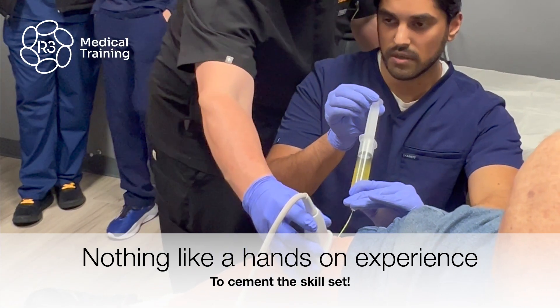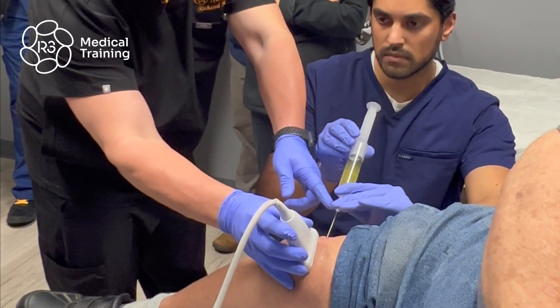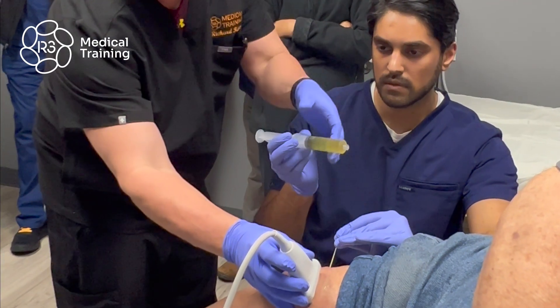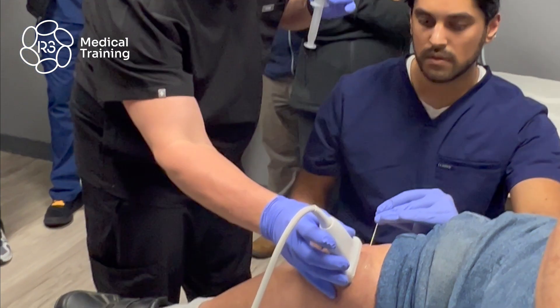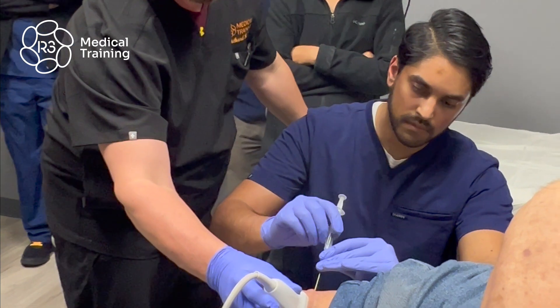So you're going to release on the pressure. You're going to hold here. Screw that off. So you won't have to stick me again?